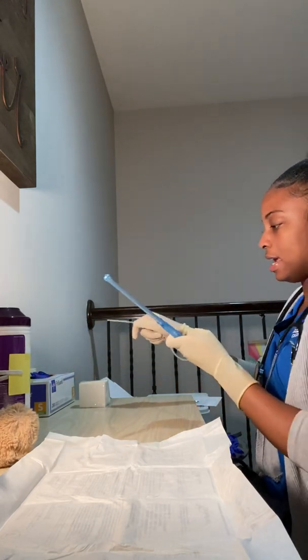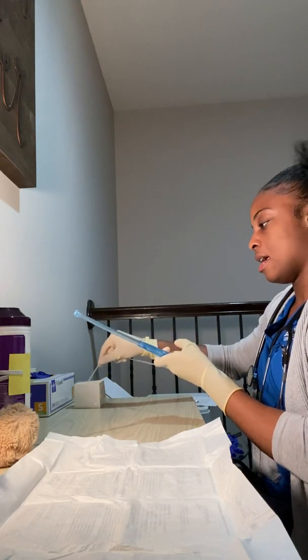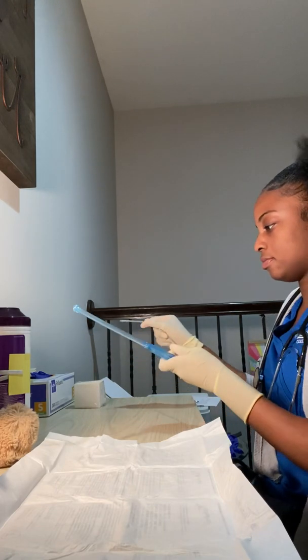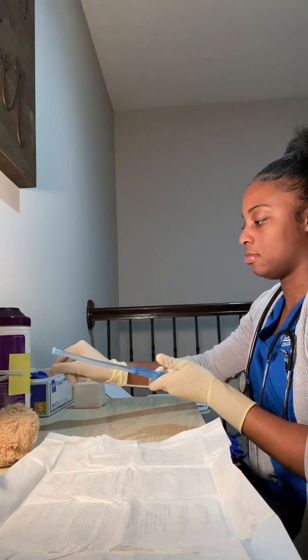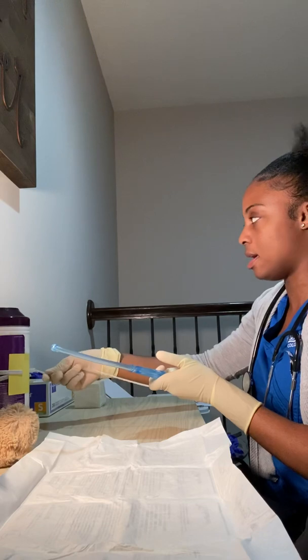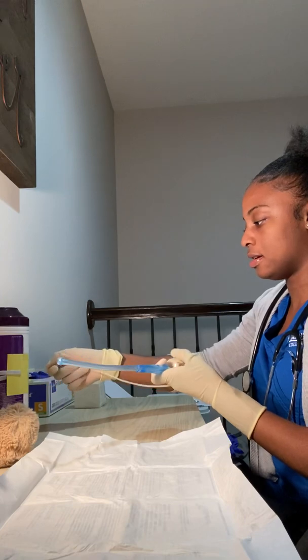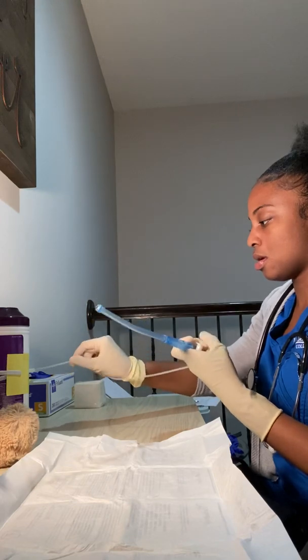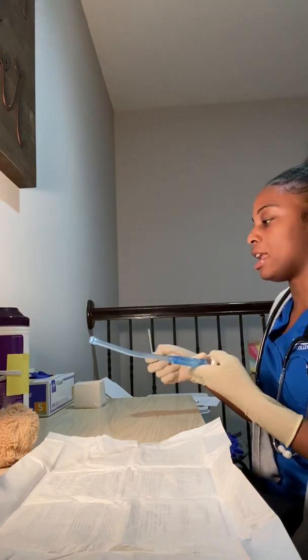Okay, I can go ahead and hyperoxygenate her again. Clean this off in there. I'm gonna hyperoxygenate my patient. Okay, and then I can go ahead and insert again. Watching those O2 sats. Her O2 sats are at about 90% right now. She's begun coughing, so I'm gonna go ahead and retract. Okay, her O2 sats have increased to about 95%.